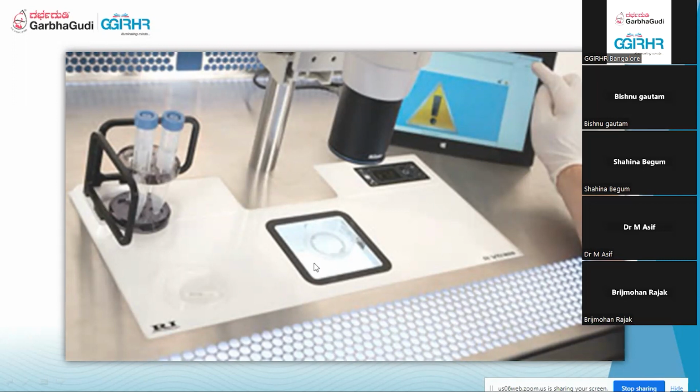The moment we place the dish, all the credentials of the patient will come. And here we usually place the semen sample, the sperm sample, and this also is monitored. So this RI workstation will monitor everything of the same patient, and you can't place another sample here and do the processing.